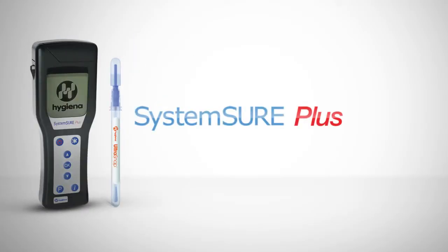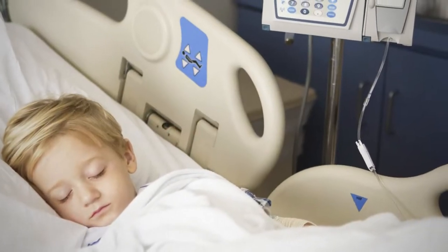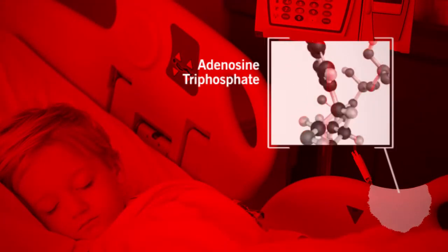The ATP Cleaning Verification System is made up of two components: the SystemSure Plus Luminometer and UltraSnap Test Device. Together, UltraSnap and the SystemSure Plus measure the ATP present on a surface.